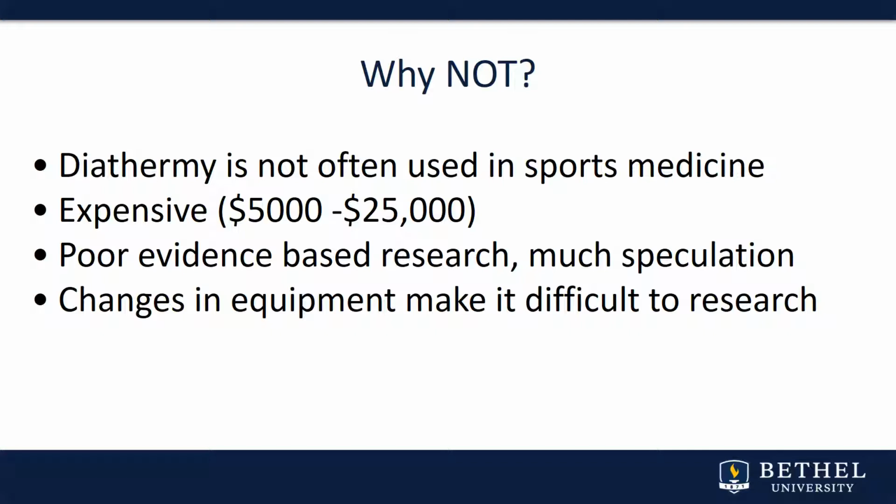There's not a lot of evidence-based research, so there's lots of speculation as to what conditions we should use it on. Is it really the best tool of our modalities? And then the changes in equipment often make it difficult to research. So if they do research on a particular diathermy unit at a particular wattage, by the time it gets published, there may be a different kind of diathermy unit out there, or you can't even find the one that we used in the studies. So it makes it a little more difficult to be consistent.